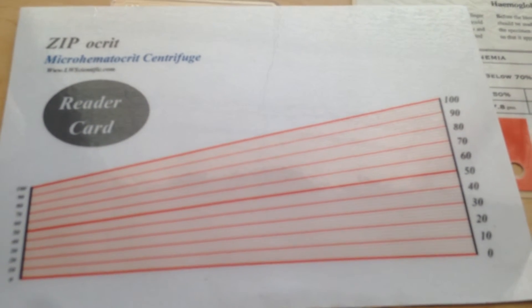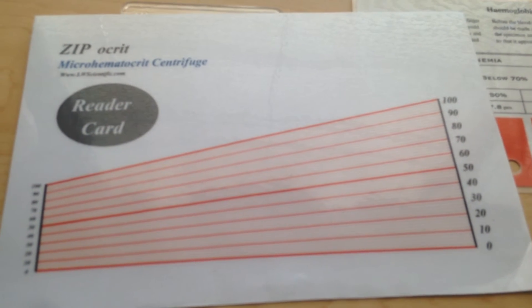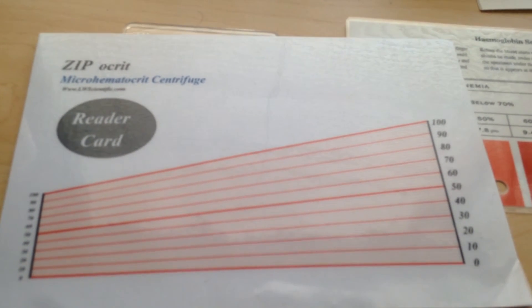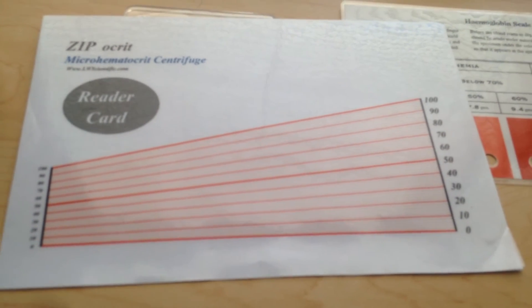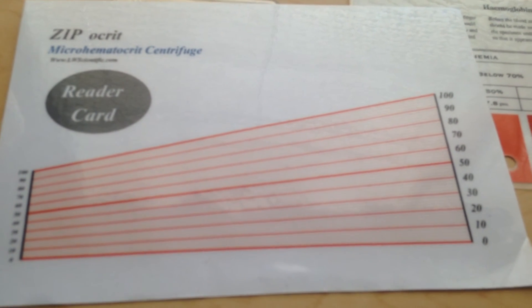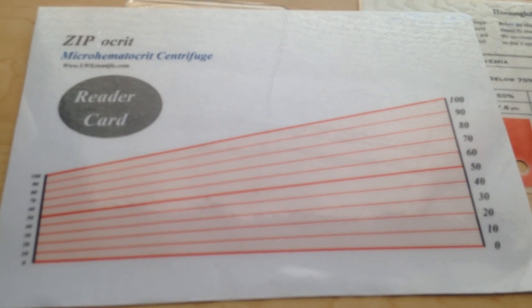Then you will measure your formed elements in whole blood on the scale, and this will give you the hematocrit value. So those are the tools you will need to perform those three tests: blood typing, concentration of hemoglobin, and hematocrit value. Shortly I will show you how to perform those tests.